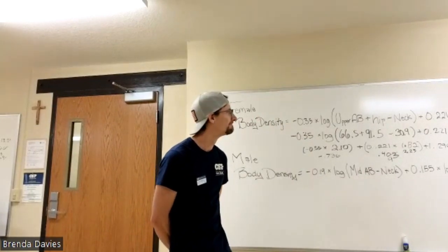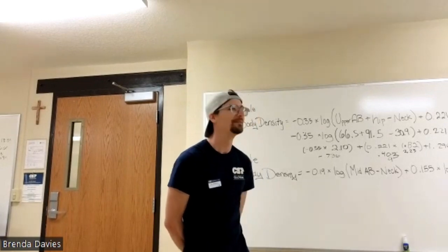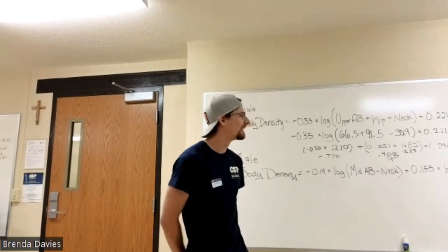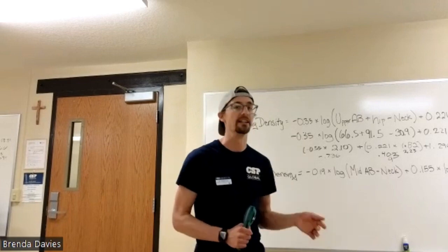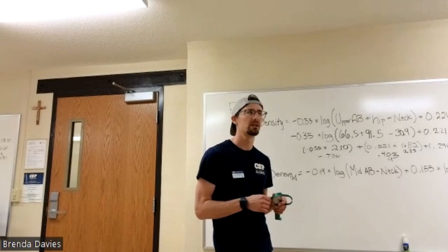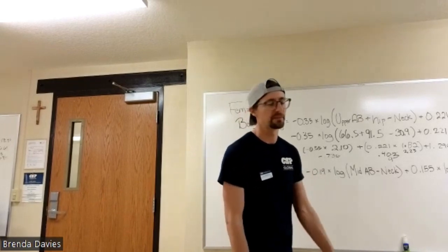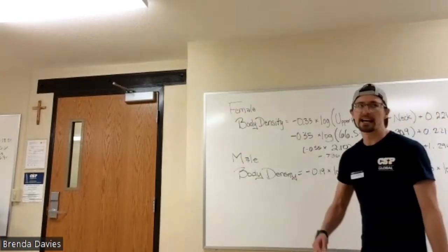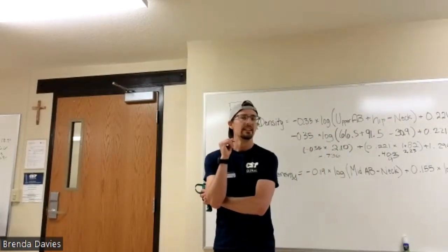That needs to be centimeters for height, right? Not inches. That's where I got messed up. I'm sorry, yeah. No, you're good. So yeah, problem solving at its best. Isn't that great? And the best part is you're like, that number doesn't look right. That happens a lot. So if you look at the number and it's like, yeah, that number is weird, what's going on here? Problem solving, math, it's just a constant battle. Well, see, it was telling me she had a 60%.